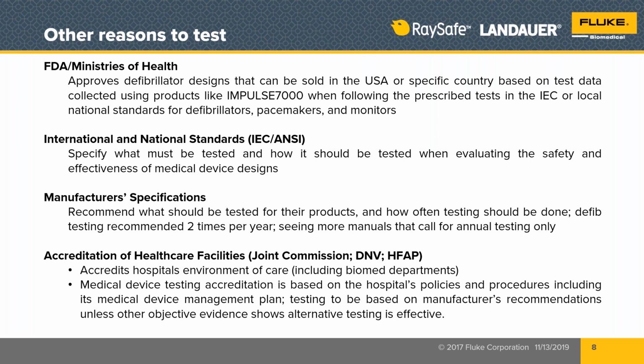And that's how we get the right testing, where we're all doing the same kind of testing on the device and with predictable results and results that match up to the manufacturer's specified pass and fail criteria.